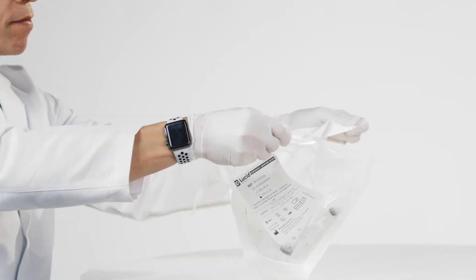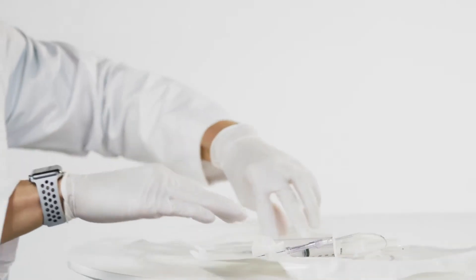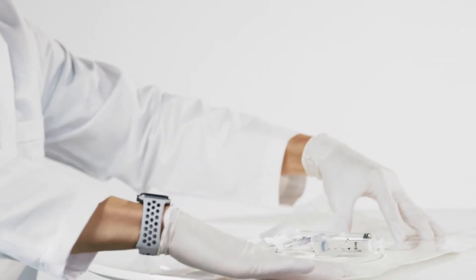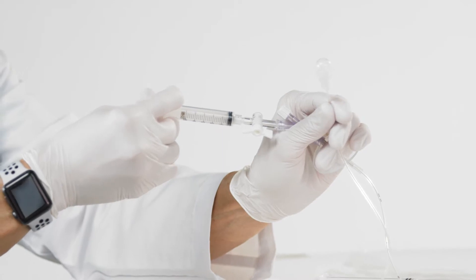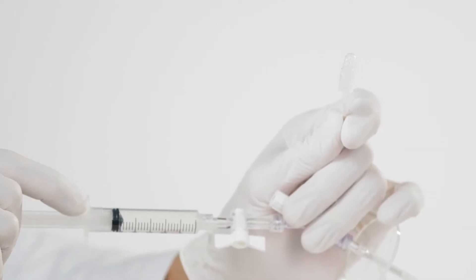The ESOCheck device consists of a capsule attached to a thin catheter with measurement markings, as well as two syringes to inflate and deflate the capsule during cell collection.